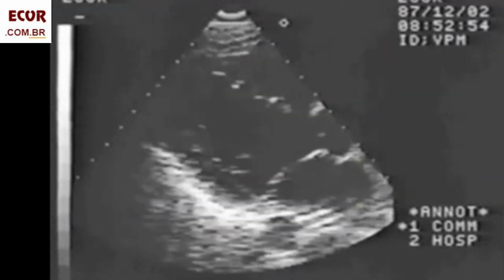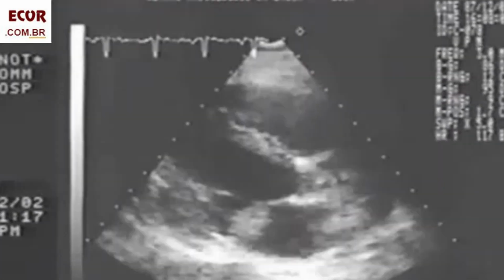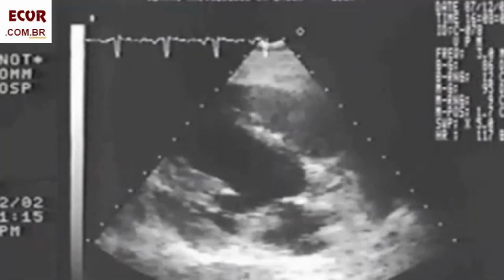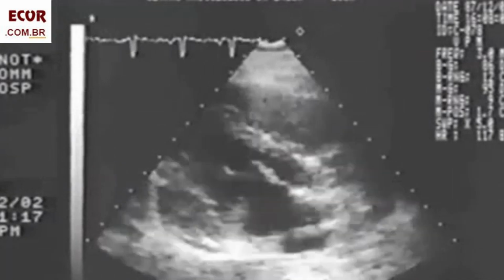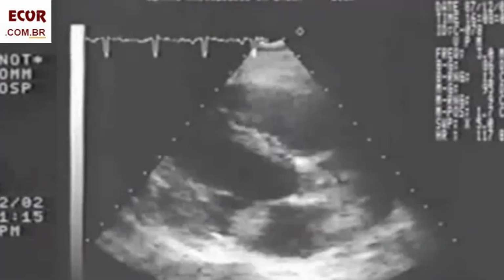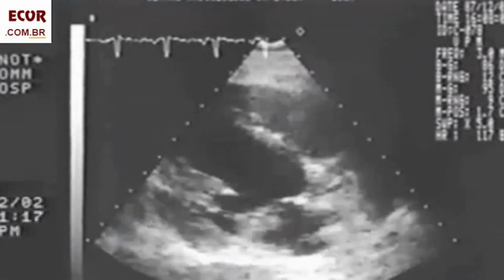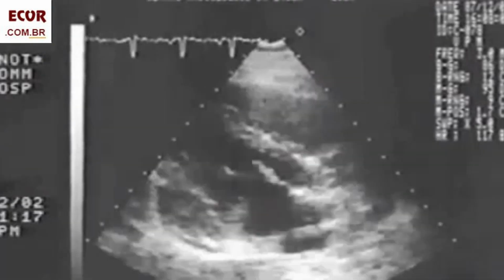But anyhow, in this particular case, the patient returned 2 days later. Look at the date, December 4th. This patient now had a huge vegetation in the mitral valve with ruptured chordae and acute mitral regurgitation, and had to go straight to surgery for a valve replacement. Remember, always, never rule out a diagnosis of endocarditis by echo.